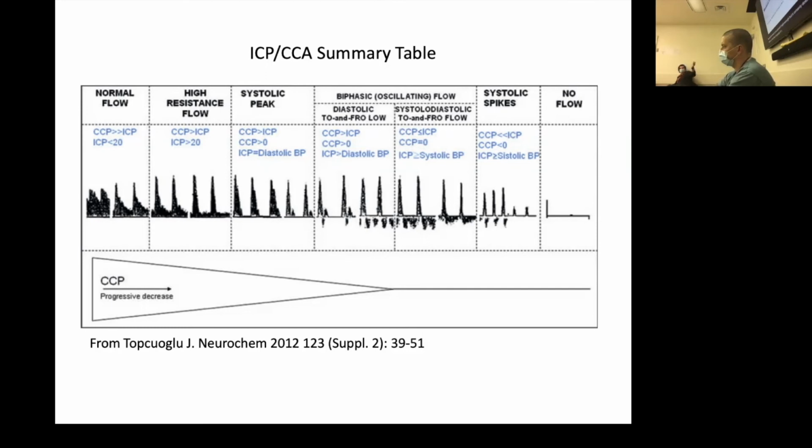If you're seeing waveforms like this, with a severely blunted diastolic velocity, that's pretty suspicious. And the next thing is really just the pretest probability, as you know. The pretest probability really does help guide your indication for therapy.